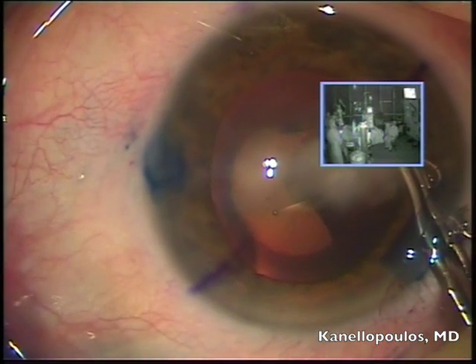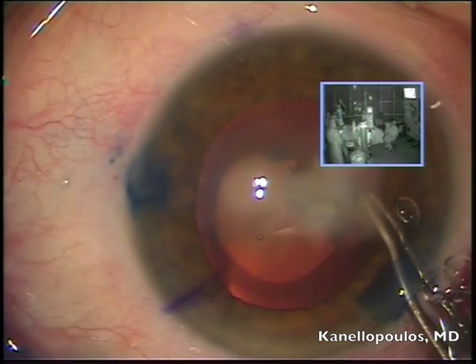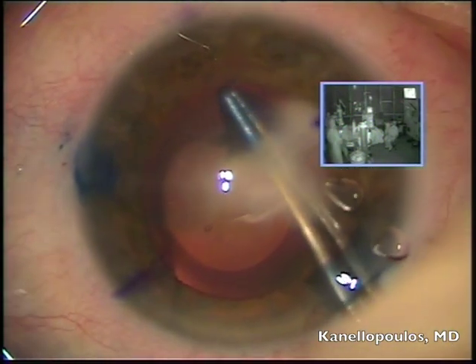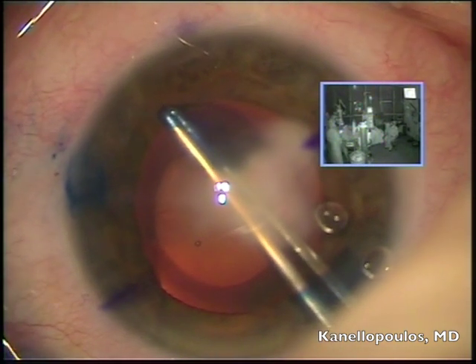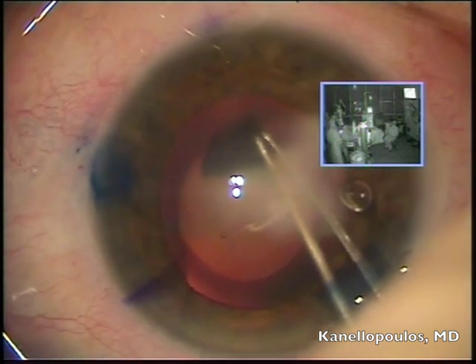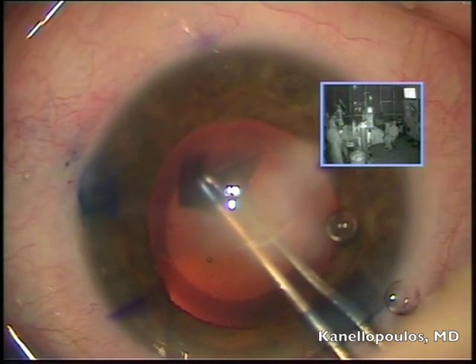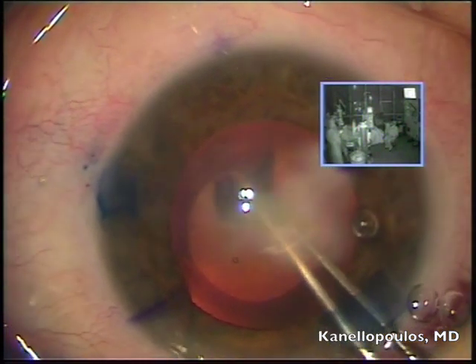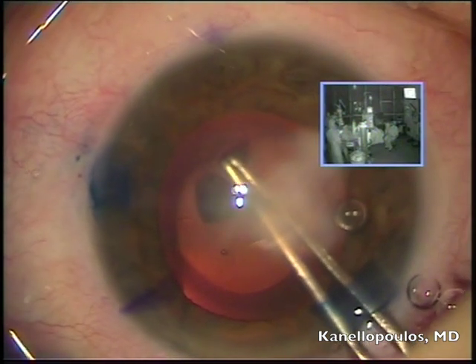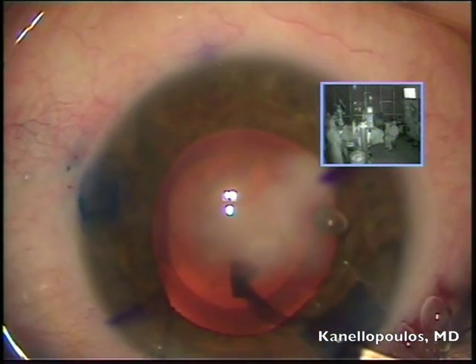I'm at a point where it's relatively easy, and now we're going to dive into the very difficult, an area of unknown. We're basically doing this with our eyes closed, and I'm not sure where the edge of the rhexis is. I'm going here with pure habit, regrasping, and bring that capsulorhexis edge within my visualization now, and then completing the continuous curvilinear capsulorhexis. The rest of the procedure is relatively straightforward.